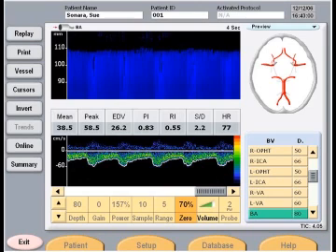Here's the M mode. So again, our same waveform at a depth of 80 that we were looking at a moment ago. But here's the information I get now from M mode. I can tell here's where I am at 80. But by looking at this M mode, see all the blue filling here? I know that I'm going to be able to trace this very easily, at least up to about 110. And then with some slight adjustments, I should be able to trace it all the way to 120.